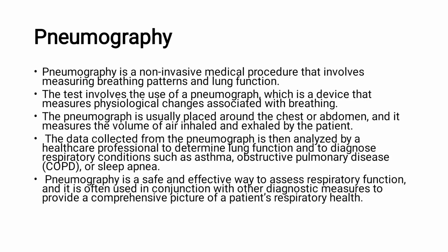Usually here we will place a pneumograph around the chest or abdomen, and it measures the volume of the air inhaled and exhaled by the patient. Then the data collected by the pneumograph is analyzed by a healthcare professional to determine the lung function of a patient. Then they will diagnose respiratory conditions such as asthma, COPD, sleep apnea, etc.